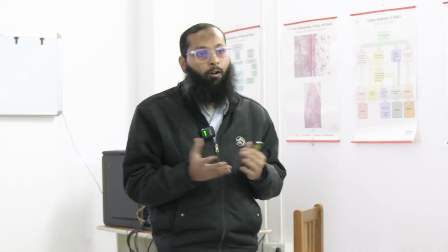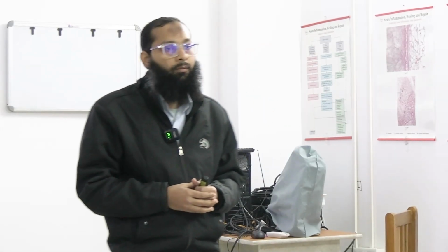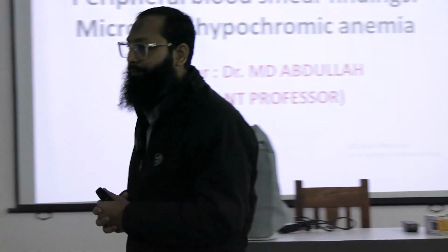Then how long will you wait? 10 minutes. Then you will wash the excess stain, dry and look under the microscope. The procedure is absolutely correct.